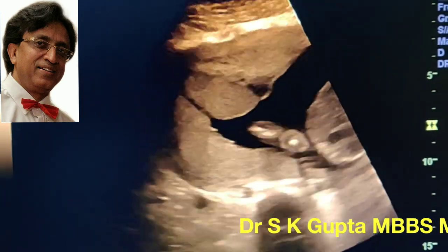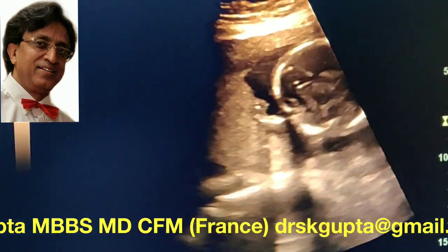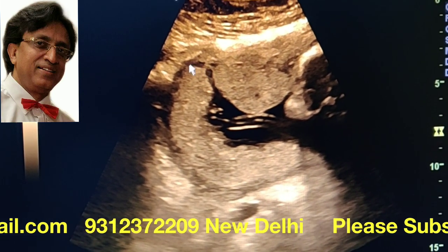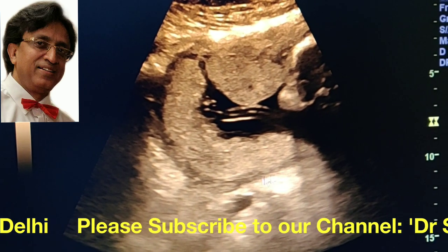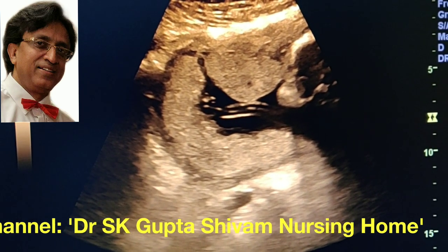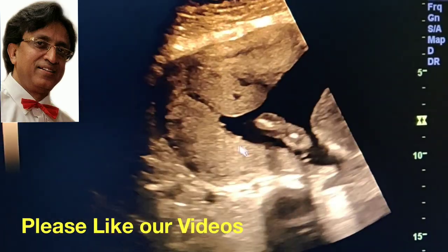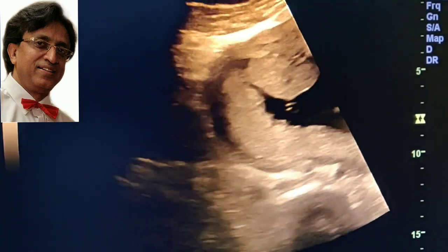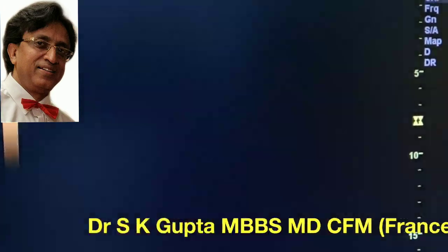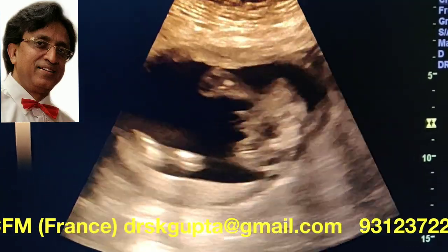She is in a 20-week pregnancy. You can see that there is a separate lobe of placenta over here, and this is the main placental mass. This is the fundus of the uterus, and the cord is attached over here. This is the succunturiate lobe and this is the main placental tissue; here somewhere is the cervix. This succunturiate lobe is to be differentiated from a uterine contraction.